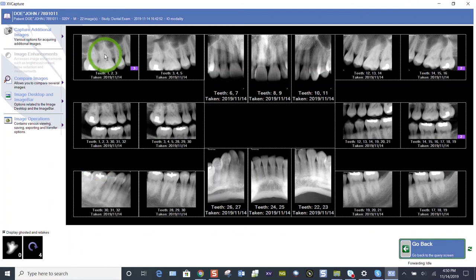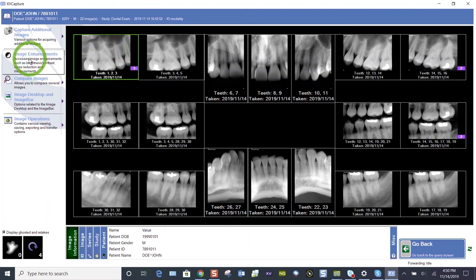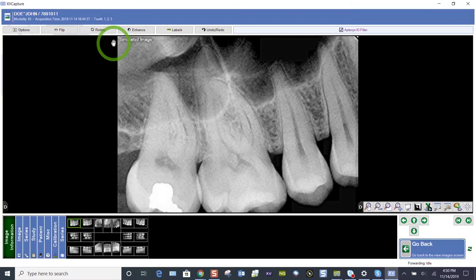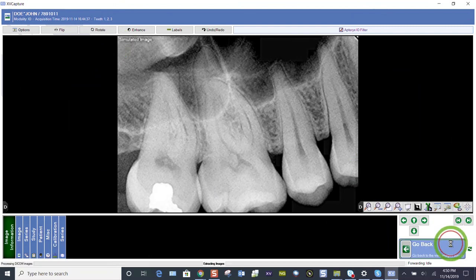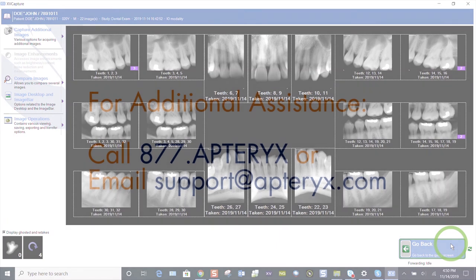And again, you can just double click on any image to get into your image enhancements. You can highlight, you see that's active or simply double click. And we're back here to our image enhancements. Just a quick overview of taking your FMX 18 and viewing it.